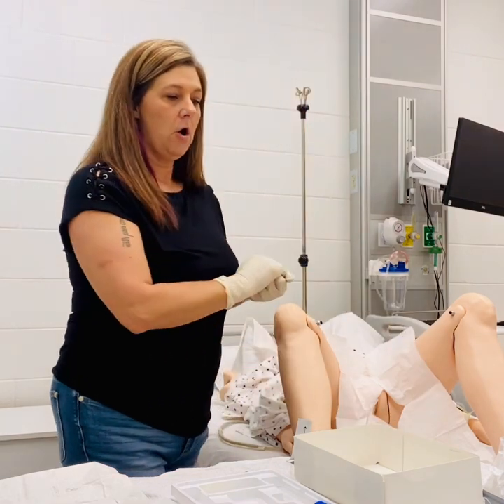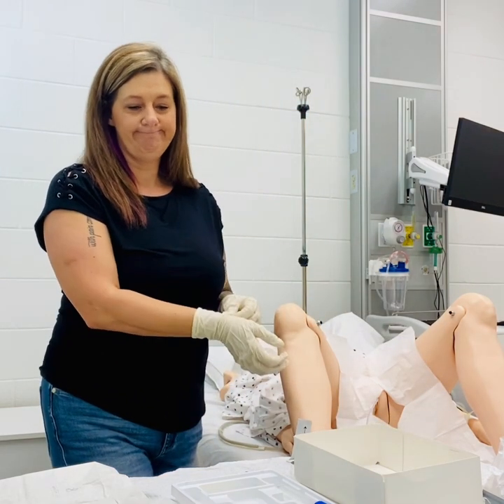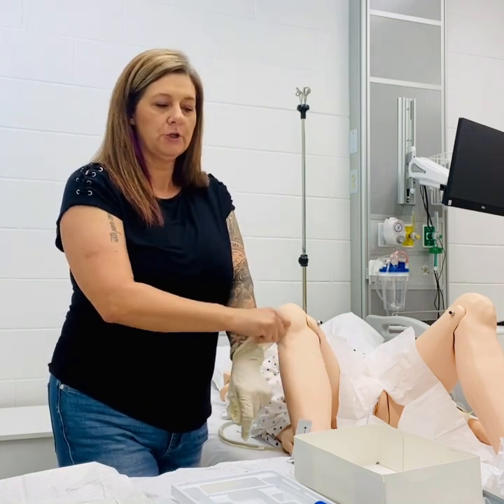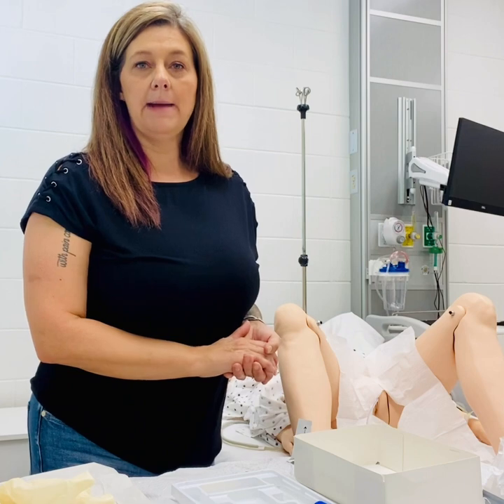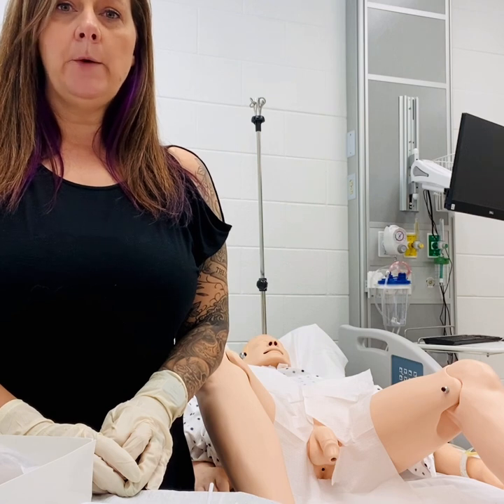And that is all you need to do for a female catheter insertion. Once you are complete, remove your gloves and wash your hands. We'll document how the patient tolerated the procedure. We also want to document the amount of urine, the color, and the consistency.